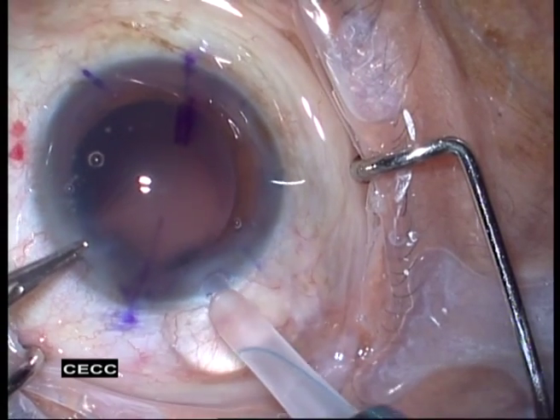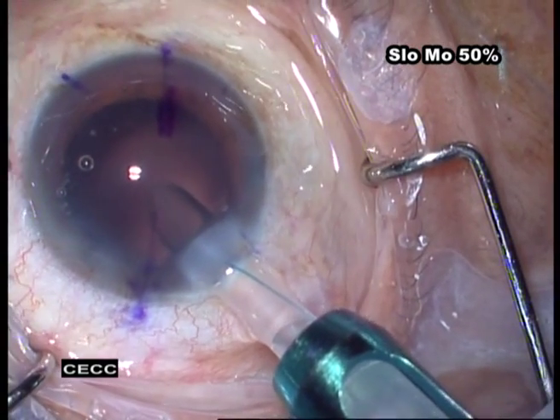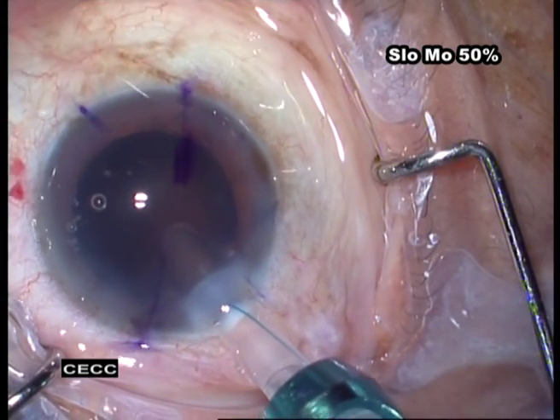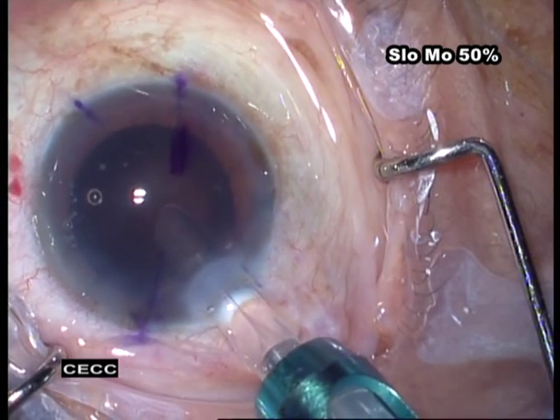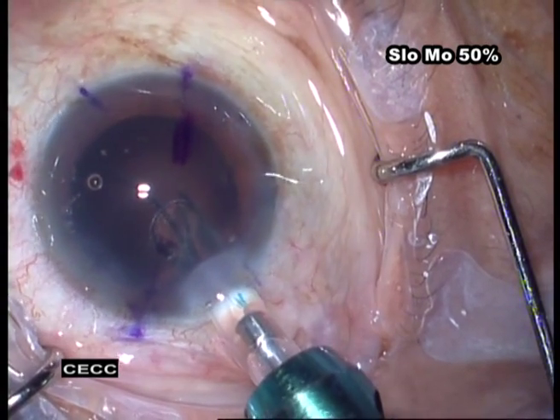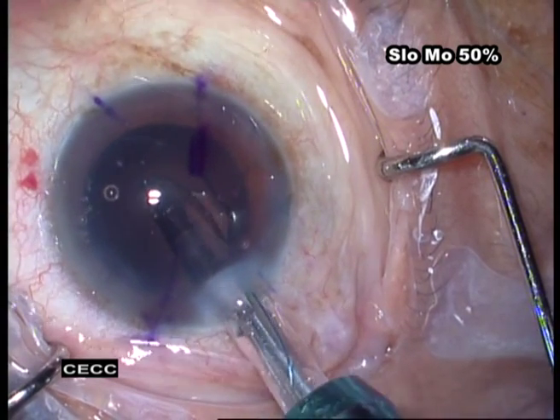Insert the cartridge tube into the incision with the bevel side down. Rotate the cartridge to point the bevel and leading haptic to the surgeon's left. Use the screw mechanism to push the lens optic forward until the leading optic edge reaches the bevel of the cartridge. When the leading edge of the optic reaches the tip of the cartridge, rotate the screw mechanism and the handpiece body as necessary to ensure the leading haptic tip is continuously pointed to the surgeon's left and is not damaged. Continue advancing the rod until the optic is fully deployed from the cartridge tube with the rod extending approximately 1 mm beyond the end of the cartridge tube.